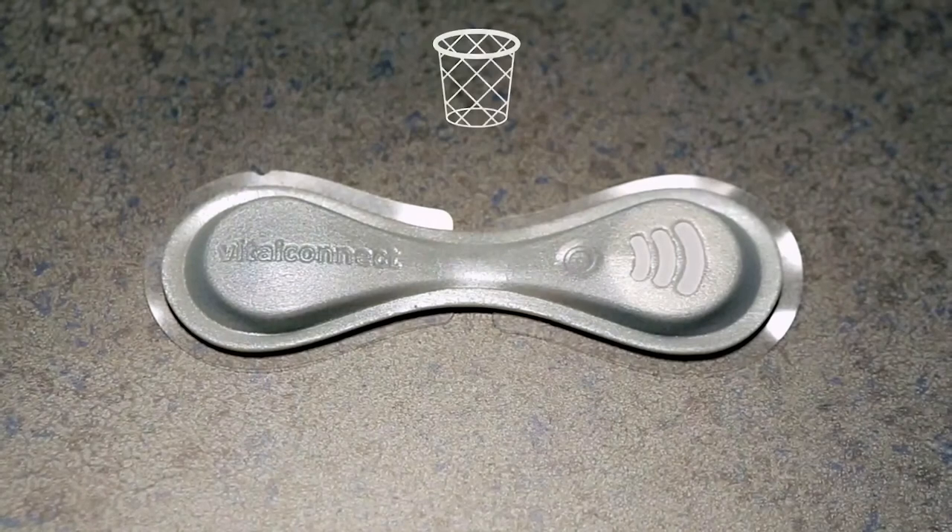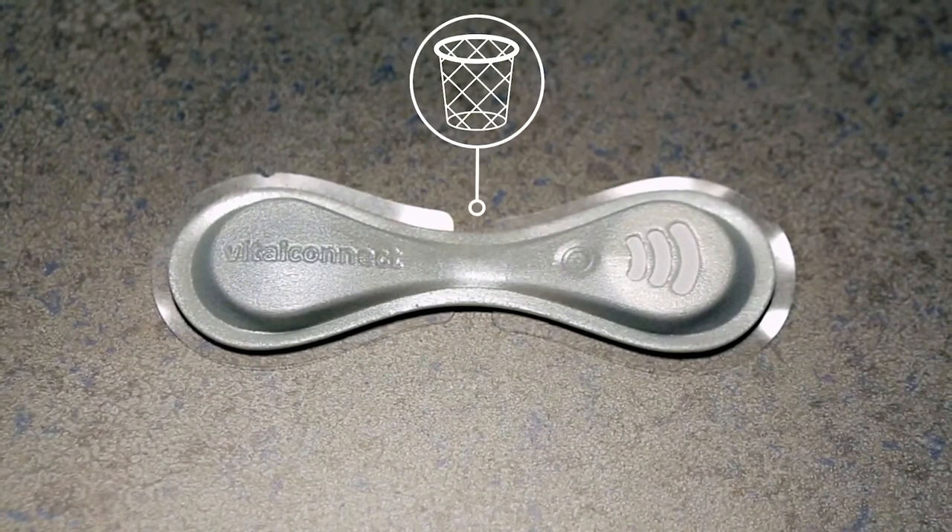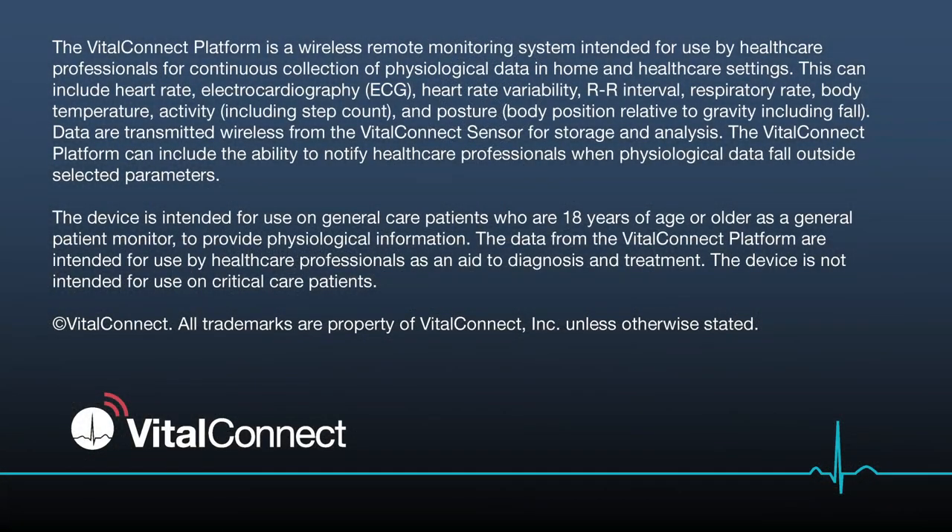Discard. The VitaPatch biosensor is disposable, but please observe local laws for disposal of zinc air batteries.